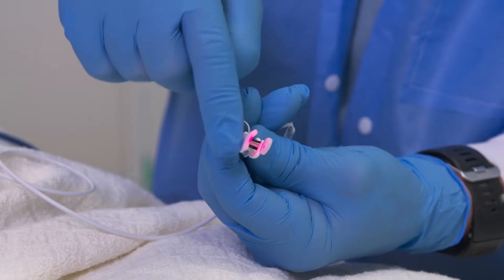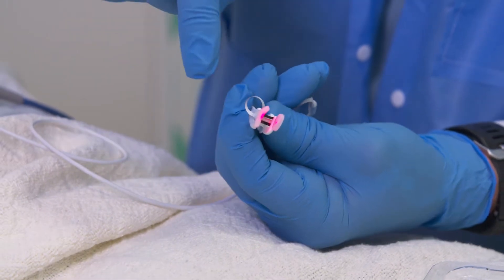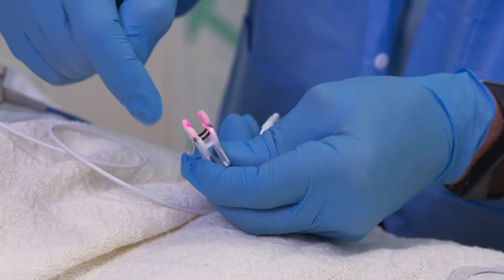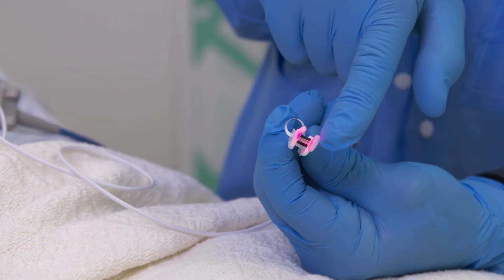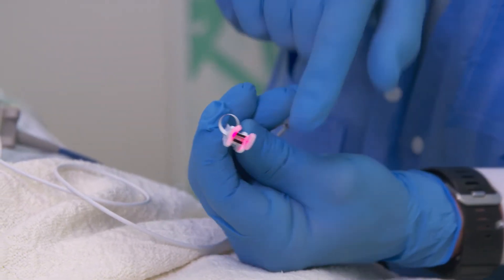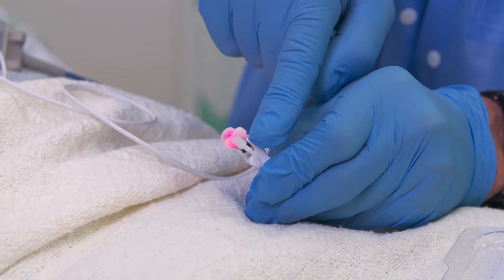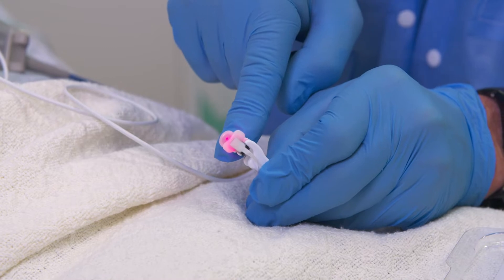This is the light emitting diode side with the red LED and the infrared LED — the infrared you can't see because it's infrared. This is the photo detector on the bottom side. When applied, the light emitting side goes to the outside of the nose and the smaller photo detector goes inside.